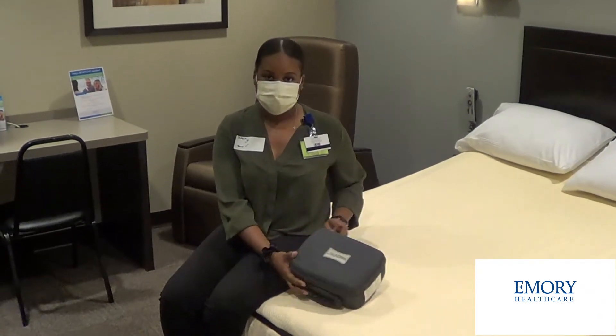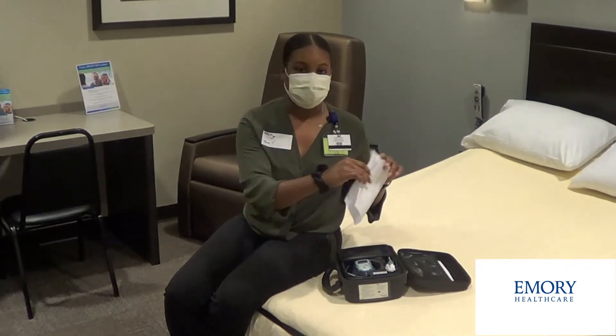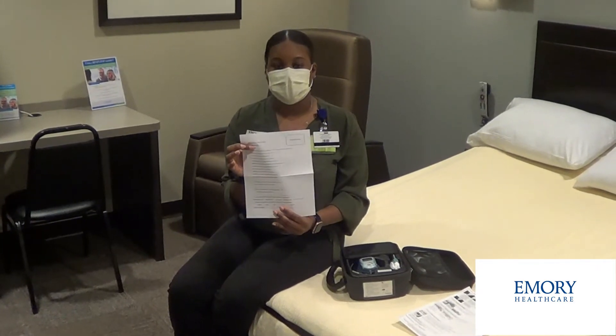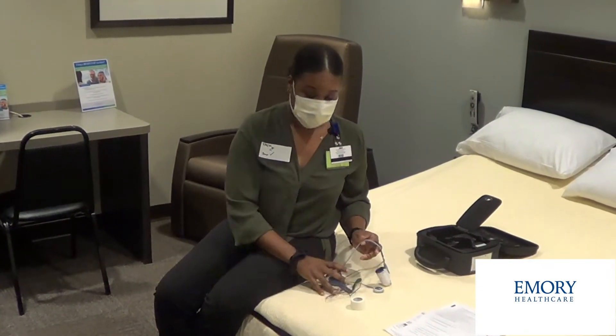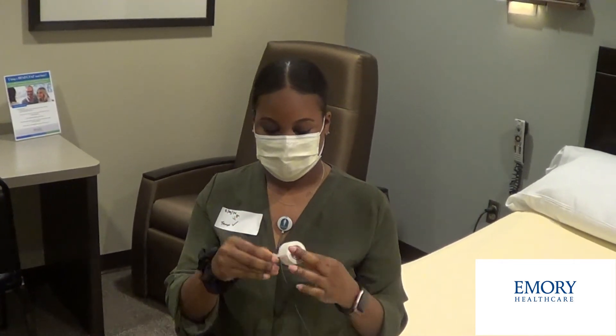With your home sleep test, you'll receive everything that you need in the box. Upon opening, you'll find directions that go over step-by-step how to set up your home sleep test, as well as a questionnaire that you'll fill out the next morning. The questionnaire will ask questions that help the doctors get a better glimpse at your night. Once you remove the device from the box, you'll realize that you have a roll of tape as well as the device itself. You'll remove the white sticker on the back of the sensor.